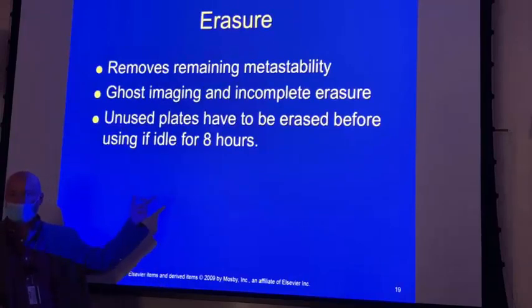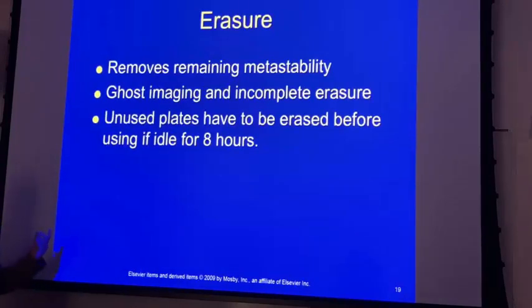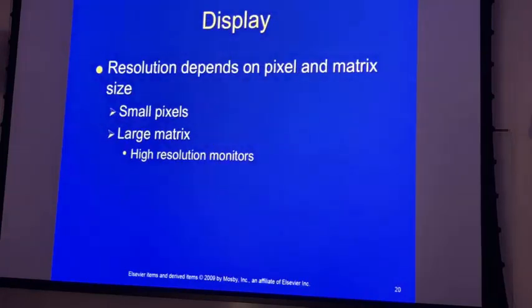Whereas these, if the eraser bank is burned out, it has a tendency to do that, but it's like everything else that's electronic: sooner or later, you're gonna have something that nobody can really figure out what happened there. Nobody's defined exactly how ghosting happens on DR yet, as far as I know.